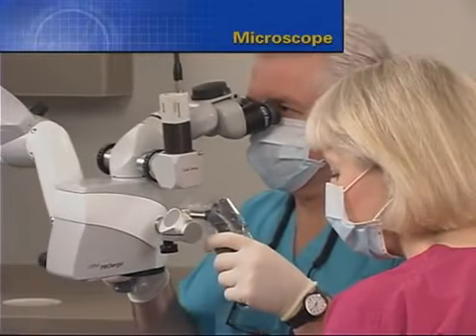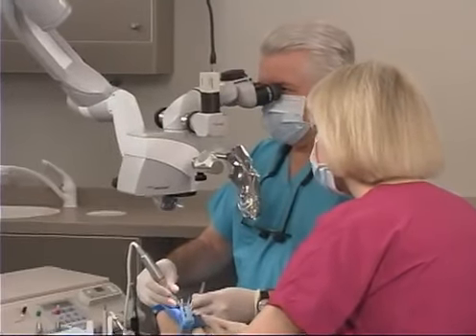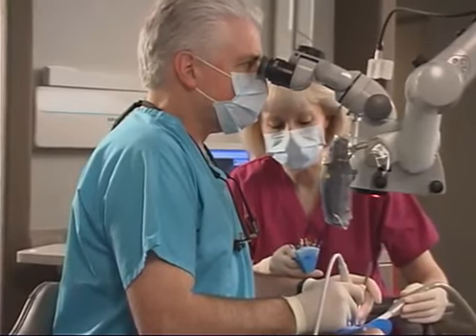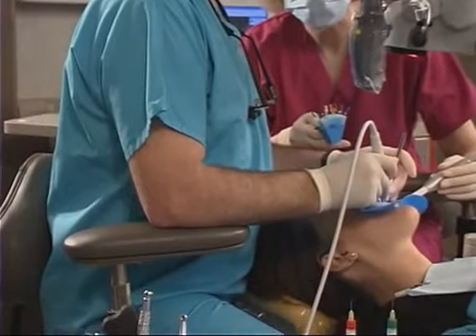The dental operating microscope provides unsurpassed vision when performing clinical tasks. Aside from remarkable vision, the microscope allows our posture to be correct, and we can work for extended periods of time.